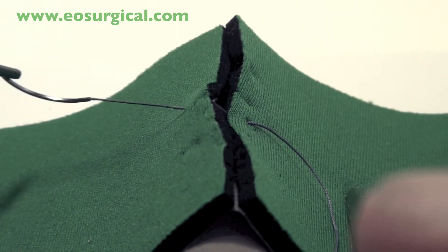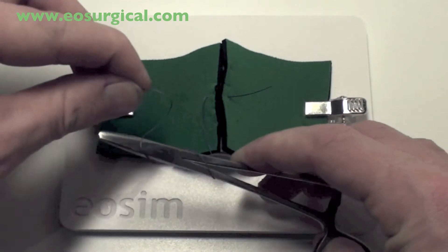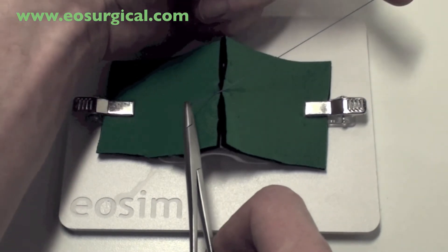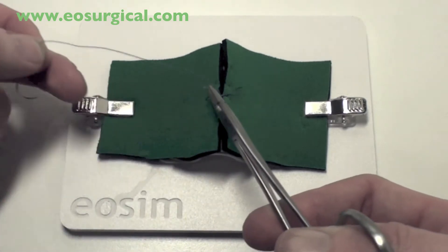Make sure to stabilize the tissues when you're pulling your needle through. Note here how the first double throw is passed over the needle holder. The left hand moves across to the right, ensuring that the knot is flat.